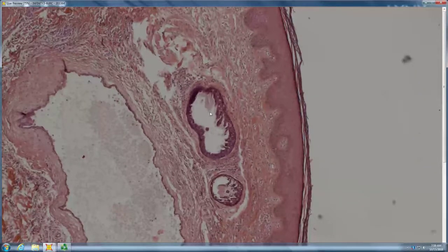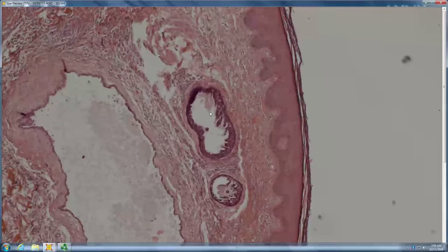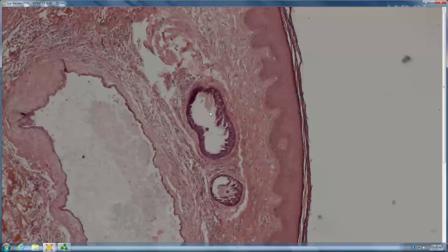That was easy. So, endocrine mucin-producing carcinoma begins in a hydrocystoma. The wall starts to become complex. It starts to look like a cystadenoma, but on the eyelid, that can be a continuum with mucinous carcinoma. And they tend to be synaptophysin positive, so they're called endocrine mucin-producing carcinoma of the lid.